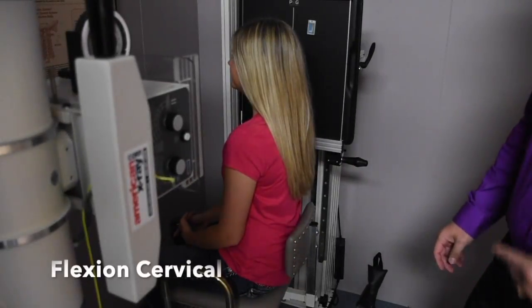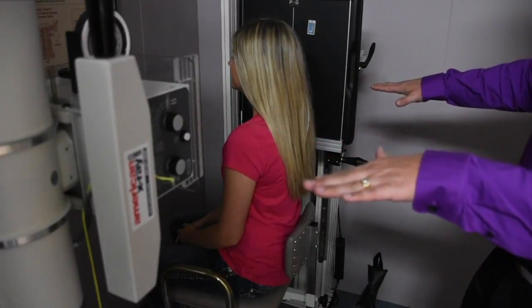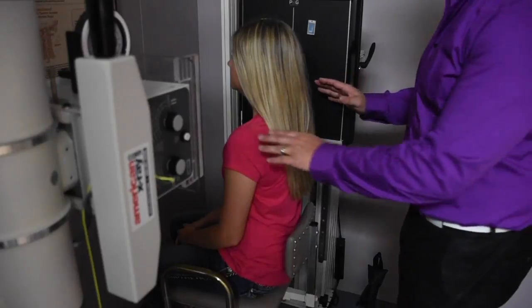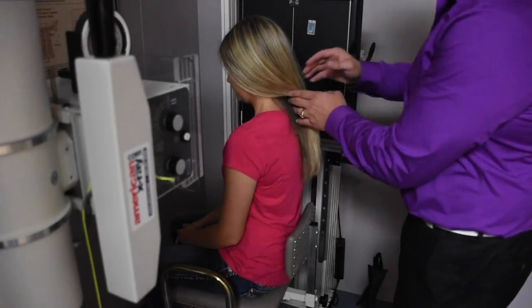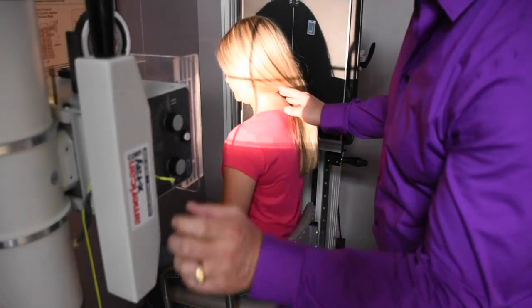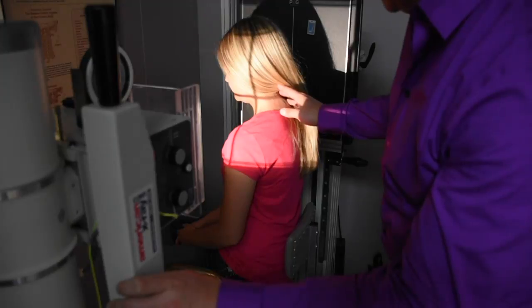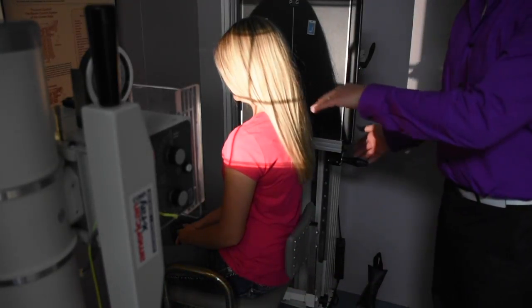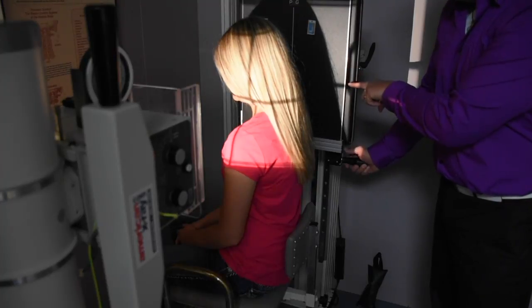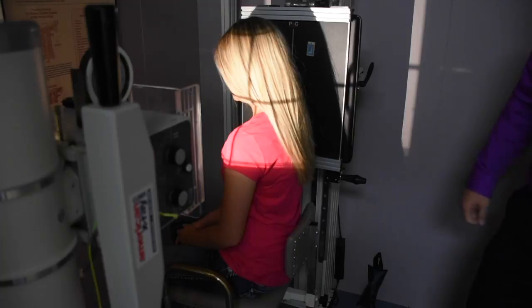Next, we're going to go over the flexion view. We've already had everything preset from the lateral. What we're simply going to do is have the patient tuck their chin down to their chest or looking down toward the floor. Then we're going to, in most cases, lower the tube to mid cervical. It's not necessary to palpate the cervical spine out, but just get it to mid cervical. You'll notice we'll have to usually lower this down anywhere from three to four inches, and line it up simply on the notch.